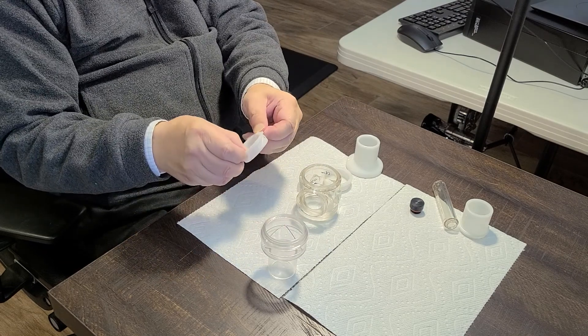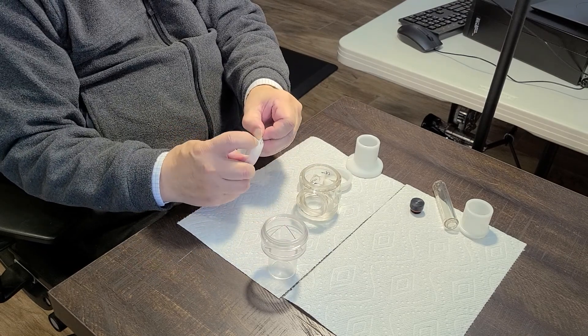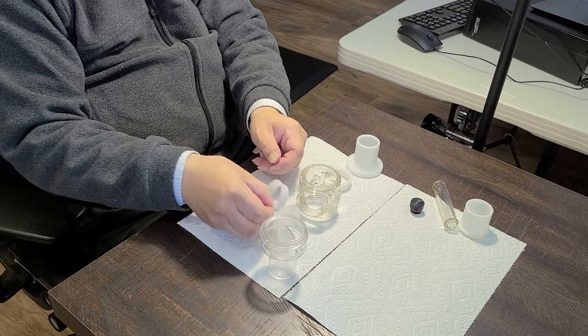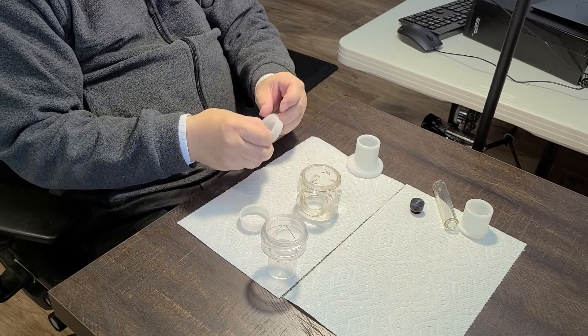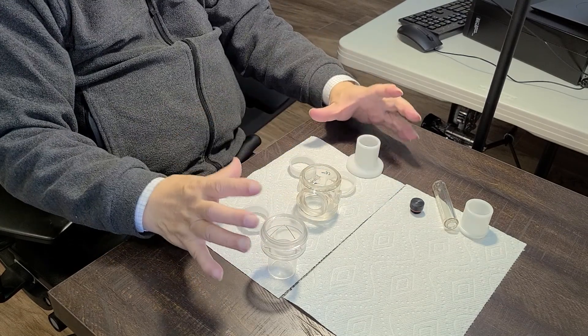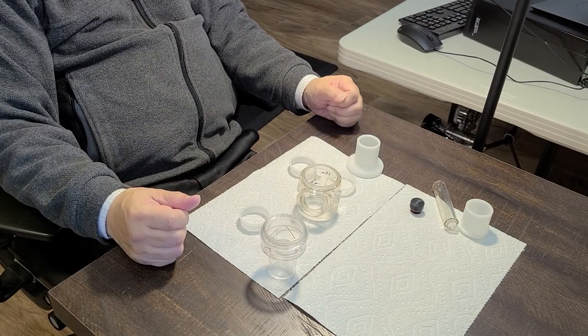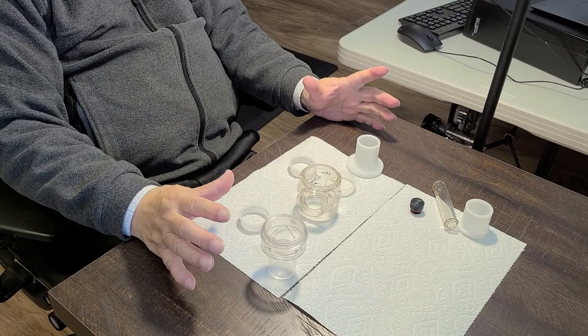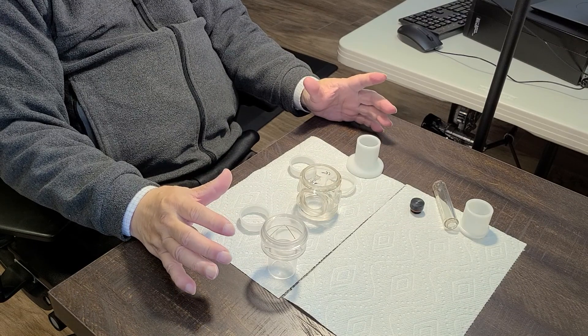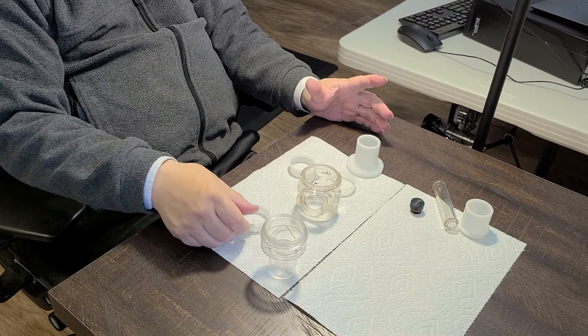Then you have to take the valve apart before cleaning. With this, you do your cleaning. When it's cleaned and dried, then you can put things back.